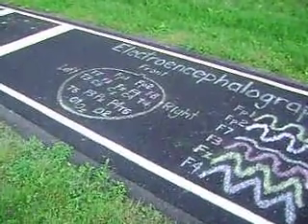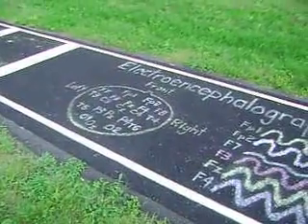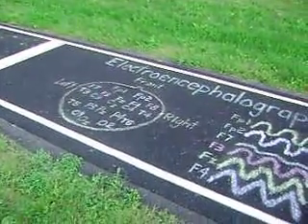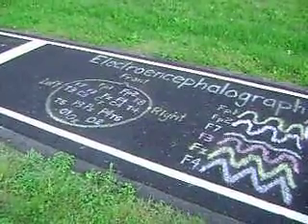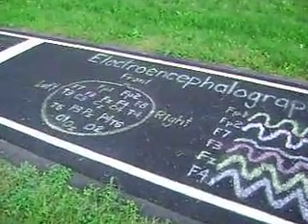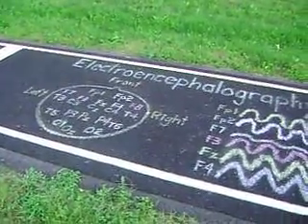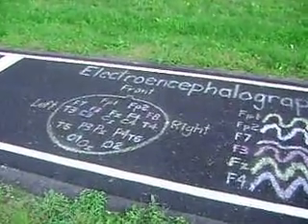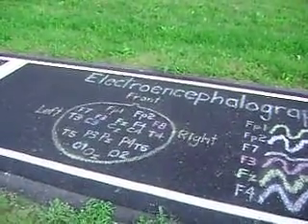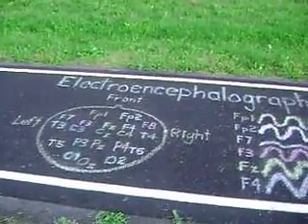Brain death. Confirmatory evidence includes the demonstration of electrocerebral silence, ECS, under proper technical conditions in the appropriate clinical context. Conditions associated with reversible ECS include overdose of CNS depressants, hypothermia, cardiovascular shock, metabolic and endocrine disorders, and very young age.